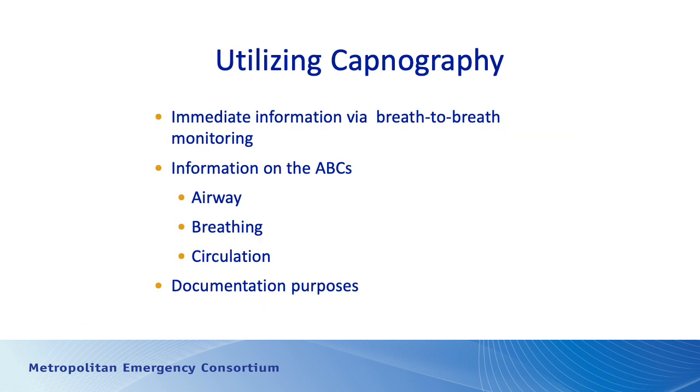Well, we can use it for immediate information via breath-to-breath monitoring, and we can use that information to make decisions and observations about the airway, about the patient's breathing capabilities and circulation. These are all things that we can assess by utilizing capnography. Capnography also is a good thing to utilize as part of our documentation process, particularly if we have any airway adjuncts in place.